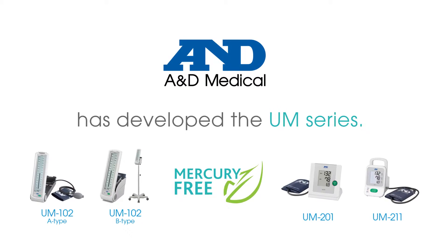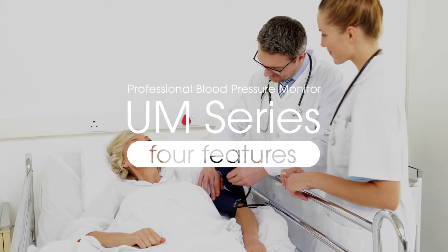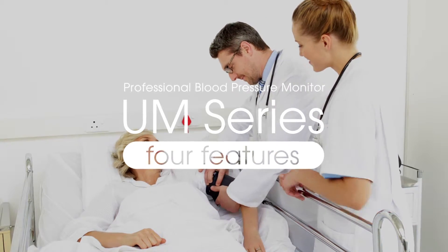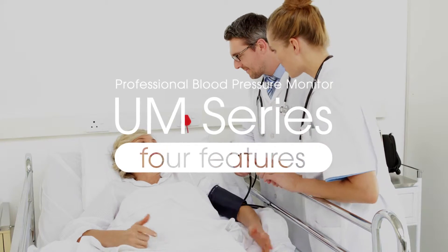There are four models in the UM-Series. The UM-Series was designed for daily measurement needs across various scenarios and is defined by four key characteristics.